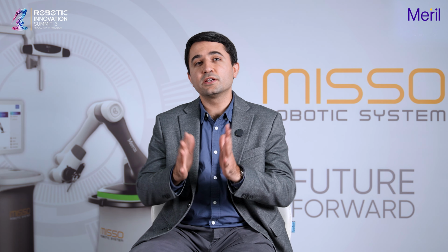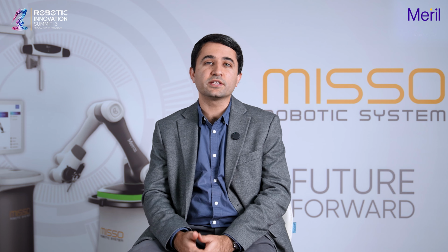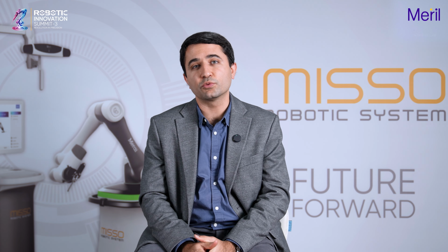Another beautiful advantage of the robotic systems is that implant alignment has now a completely different dimension. That means you don't have to be restricted to the mechanical workflow which conventional techniques permit us only to do. In robotics, you can explore the alternate alignment methods by placing the implants, whether it's the femur or tibia, in slightly different ranges which can be assessed and properly, accurately placed as per the evidence that the robotics perfectly puts the implant where you want it to put.